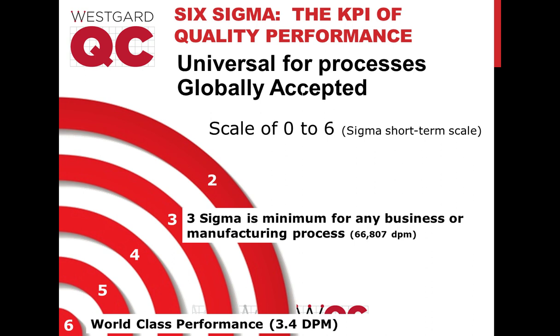So we can sort of couch each result in the context of its quality. For a Six Sigma assay, when you report that out, you can let the clinician know if there's a change here and it looks like it's clinically significant, we're very confident that we're going to be wrong about that less than 4 times out of a million reportable results. So if you see a change, it's probably a change in the patient. A low sigma, you start cautioning the clinician, don't make a decision yet, let the change get bigger, do more monitoring.